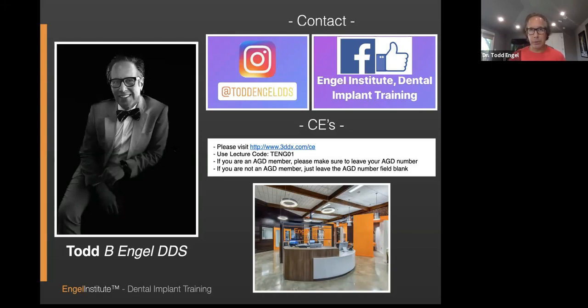From that point, we will drill a couple of drills wide. I will then, through the guide, get my autotome, which is a phenomenal machine. It's one of my 3 to 4 favorite pieces of technology I have ever owned. You should go to salvin.com and look at the autotome. It's amazing. They also have periotome tips.